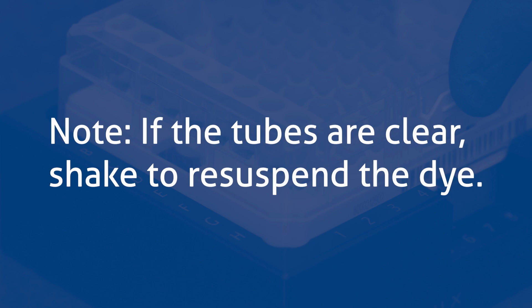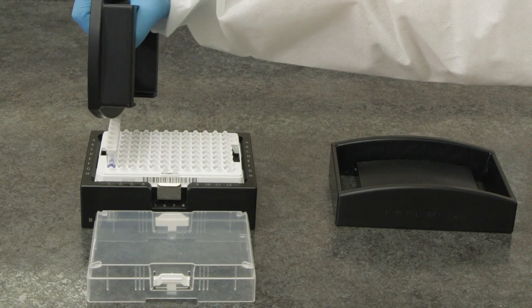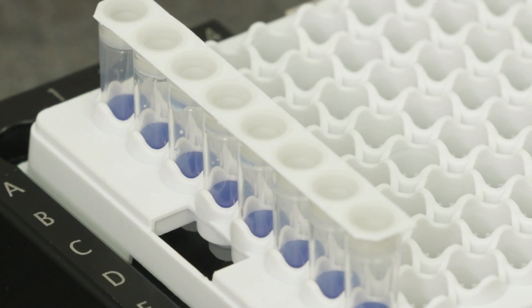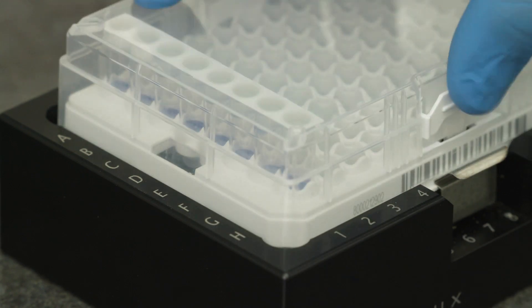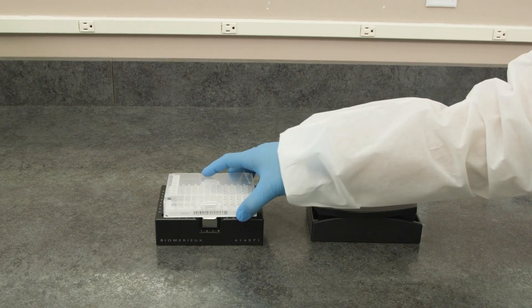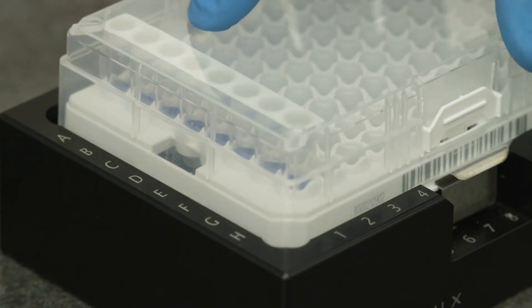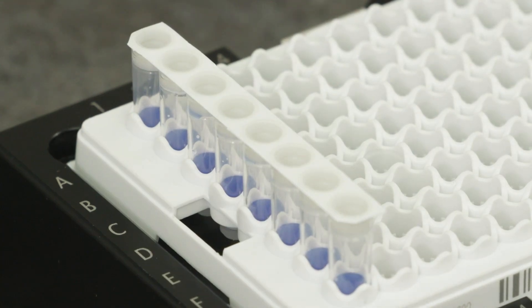If the tubes are clear, shake to re-suspend the dye. Using the capping tool, press down on the tubes to secure them in the lysis rack. Visually inspect the lysis tubes for liquid that may be adhering near the top of the magic cap. To force the liquid to the bottom of the tube, remove the lysis rack from the heavy block and swing the tray down, then immediately stop. Place the lysis tube holder back onto the heavy rack holder. Visually inspect the magic cap to ensure there is no liquid on the magic cap before adding sample.